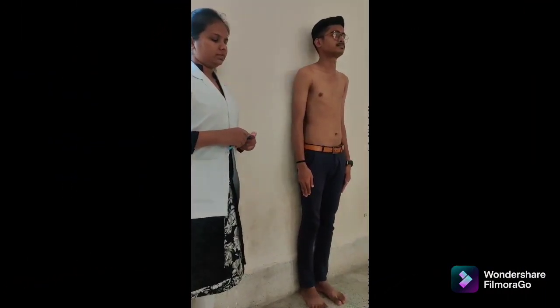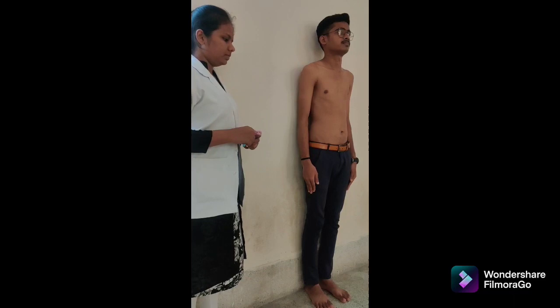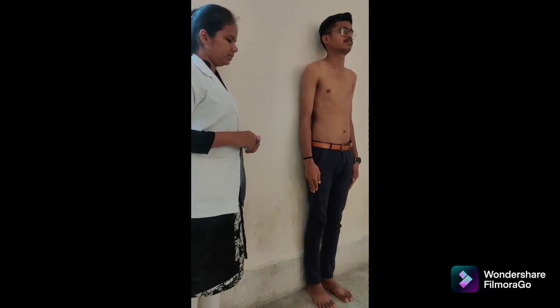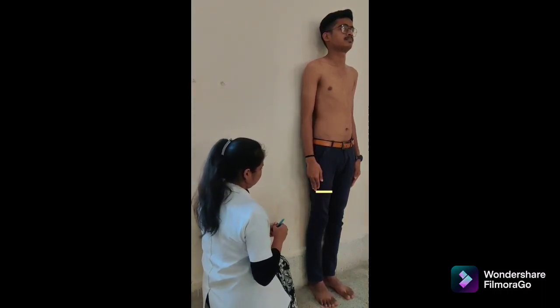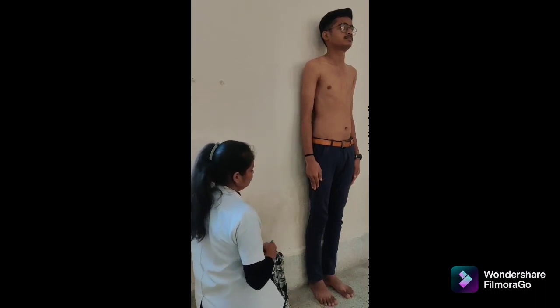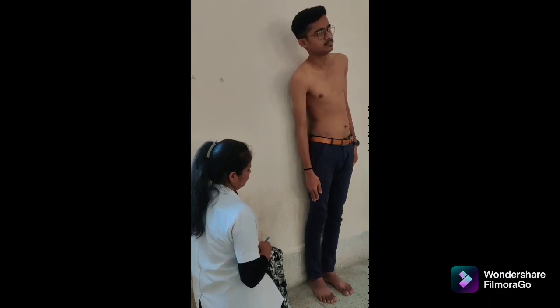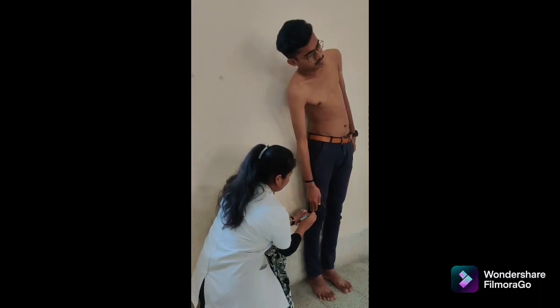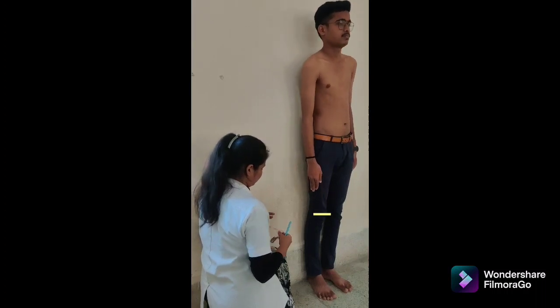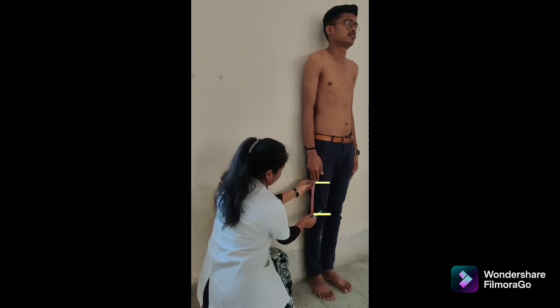Third method is fingertip to thigh for thoracolumbar lateral flexion. Patient position: standing with back against the wall, shoulders and arms hanging freely at the sides. Place a mark on the thigh at the level of the middle finger. Instruction: bend to the side as far as possible while keeping the back and shoulders against the wall and both feet flat on the ground with knees extended. At the end of the motion, make a second mark on the leg at the tip of the middle finger. The distance between the two marks is the value for thoracolumbar lateral flexion. Normal range: 21 cm.